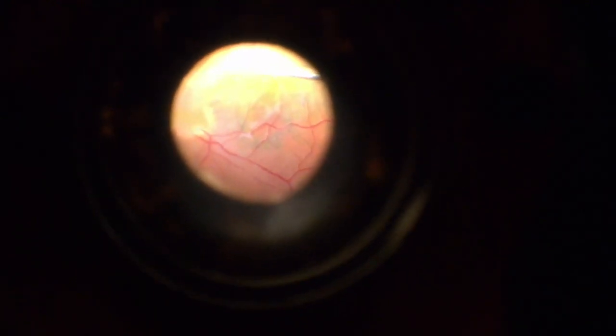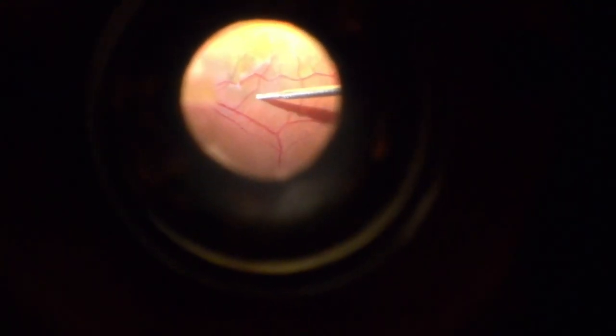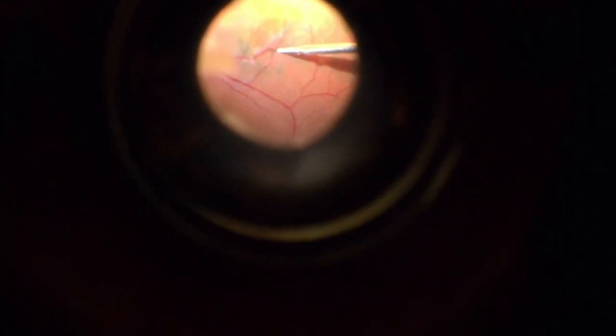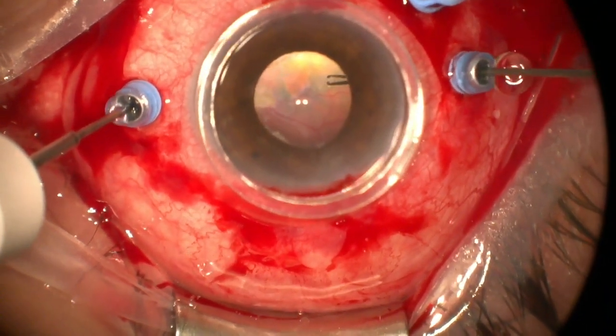So again, I look for the green. I went to, in this case, the inferior macula, right? Now we're going to switch gears and go to the superior macula. Look for an area of green, because I know that's the ILM. You can see that roll coming up there. So I think the loop scraper in a case like this will actually be more difficult to use in some ways. Probably there, are we on the screen? Yeah. Because it's a little flimsy.